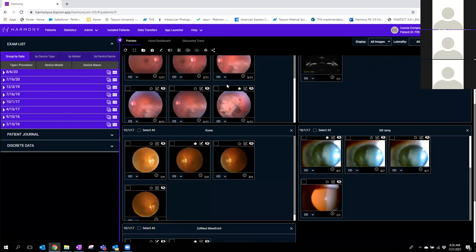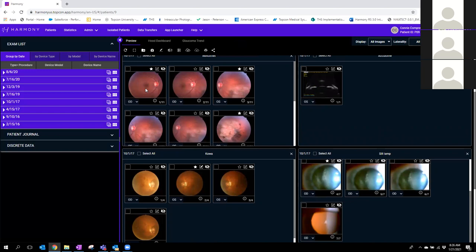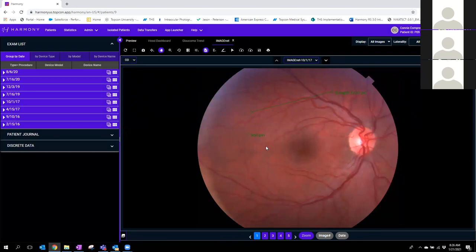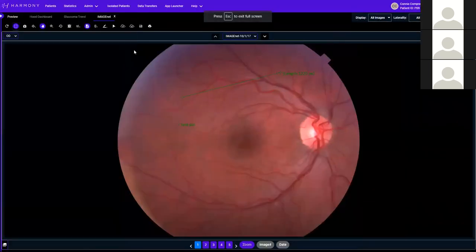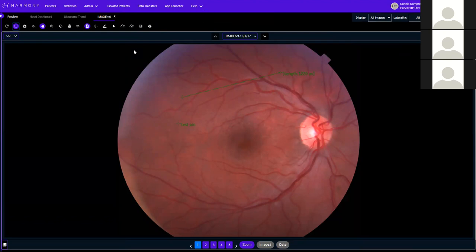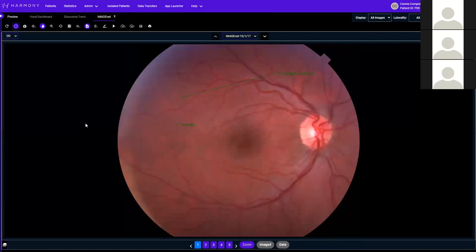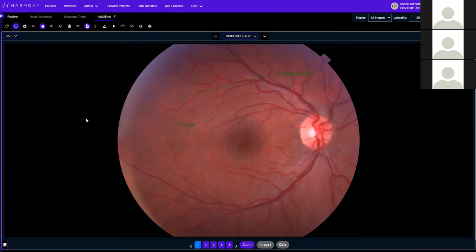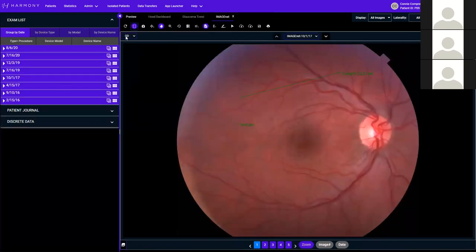So that was simultaneous view. Now let's look at one exam in large view to get through all the toolbar icons. Single click selects, single click again deselects; for large view just do a quick double-click. Now we're in large view with a couple of annotations on there which we'll get to. The first icon is refresh — it takes you back to when you first clicked on the media, resetting the view. The second icon is full screen. In this case it gets rid of your Windows taskbar and website shortcuts. On the left side there's a purple arrow you can click to toggle your exam list on and off.